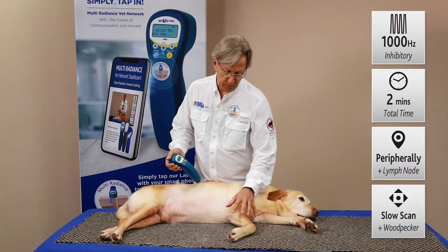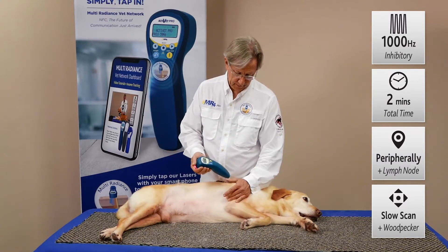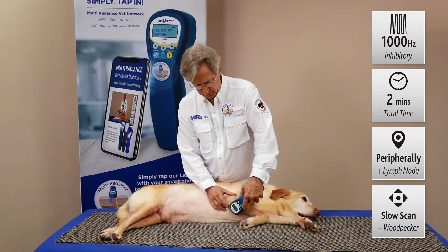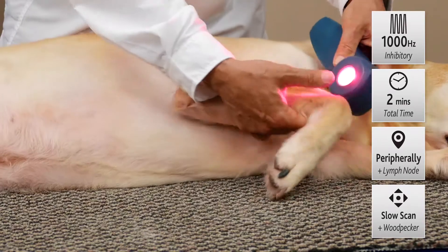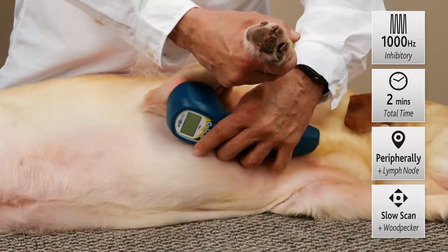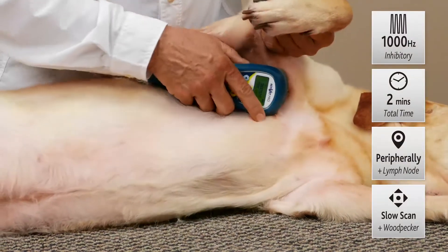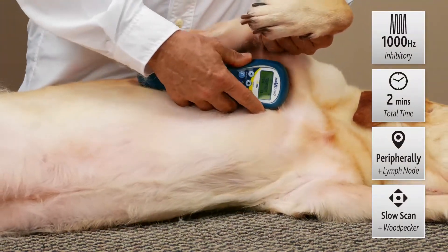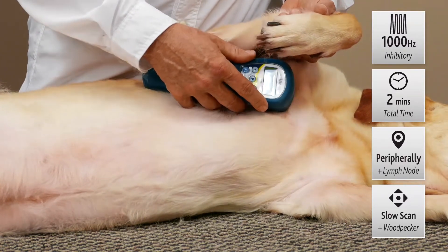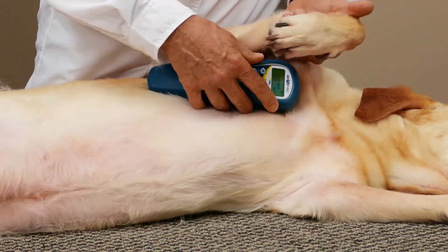So if we were assuming for a moment that we had swelling along this limb, then we would run the laser parallel to those blood vessels, and then come up to the proximal lymph node right inside the shoulder here, and apply pressure and release, pressure and release right on that lymph node, and that's going to help mechanically facilitate drainage of that fluid.